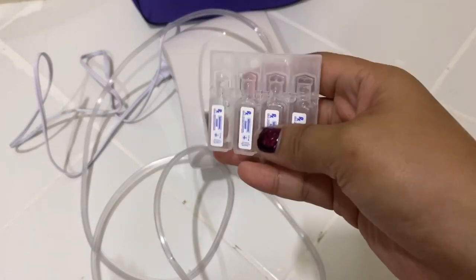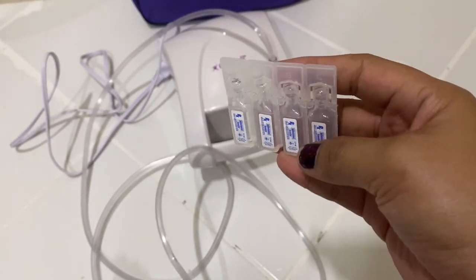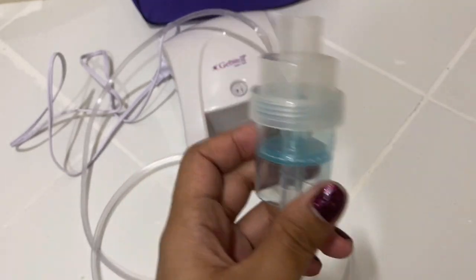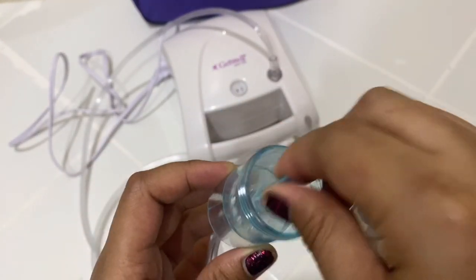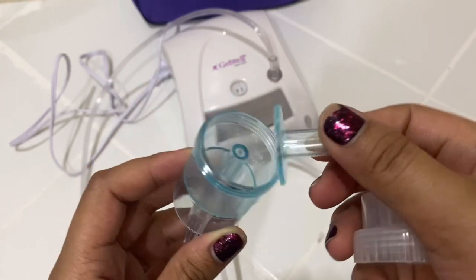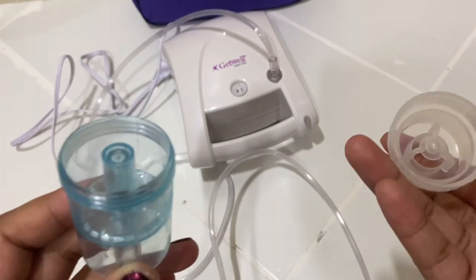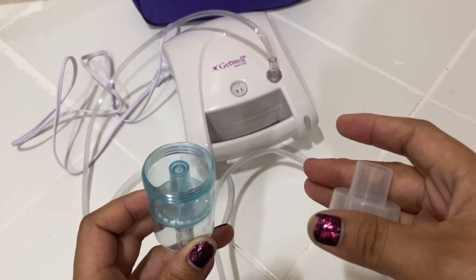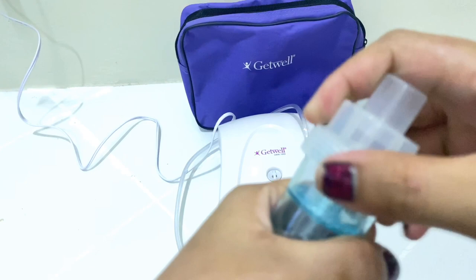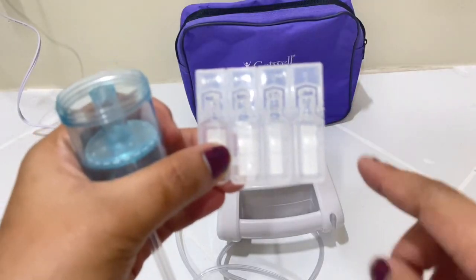Ito yung itsura ng medicine na ilalagay natin sa medicine cup or sa medicine bottle. And the medicine cup has two parts. Ay, may ganito siya. And huwag nyo siyang tatanggalin. Dapat nandyan lang siya sa loob. And make sure na clean yung bottle before using it. So again, make sure na clean yung medicine cup natin before natin ilagay ang medicine.